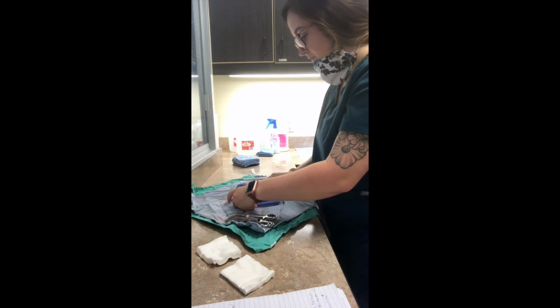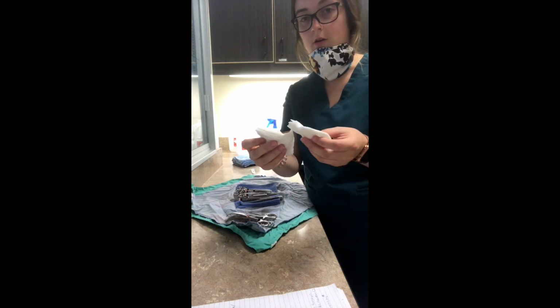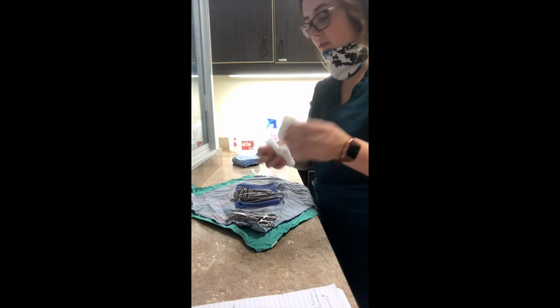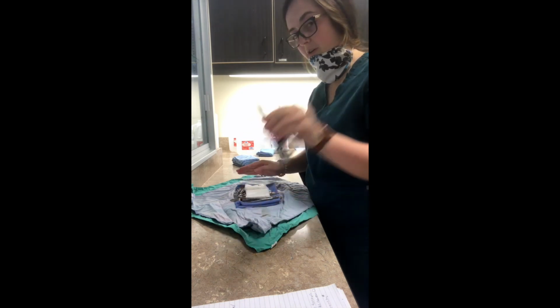Our gauze that have already been counted out. We use 15. I'm going to put our towel clamps on top.